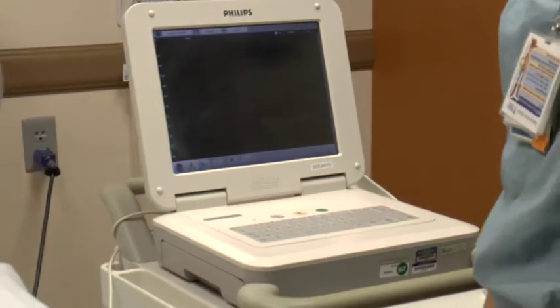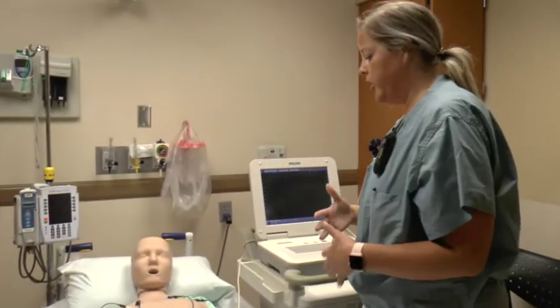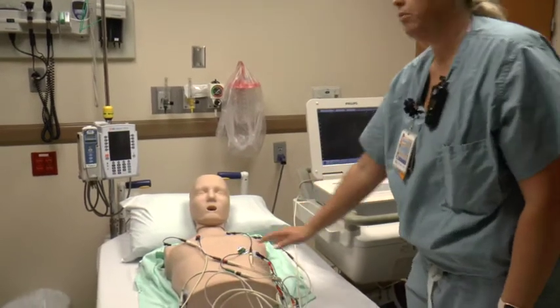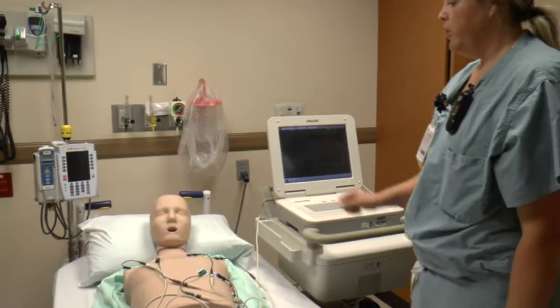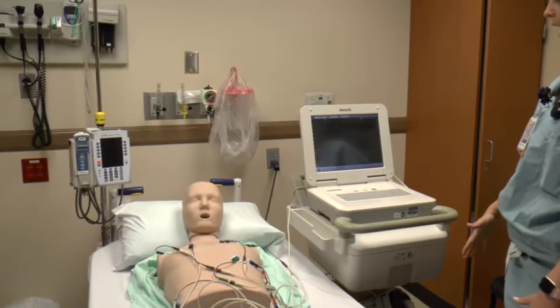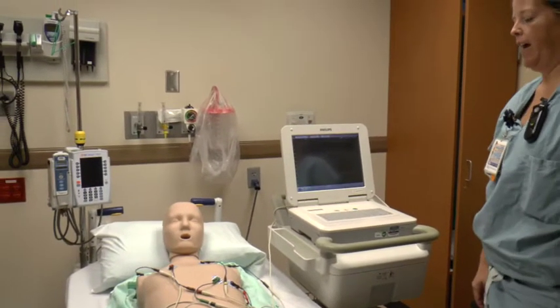If you're having a hard time getting a good reading — for example if it's a gentleman with a hairy chest — do your best to shave at that hairline, or take off the sticker and replace it with a fresh one to ensure good contact. You can also lower the head of the bed to help the patient relax and eliminate any type of artifact if possible.